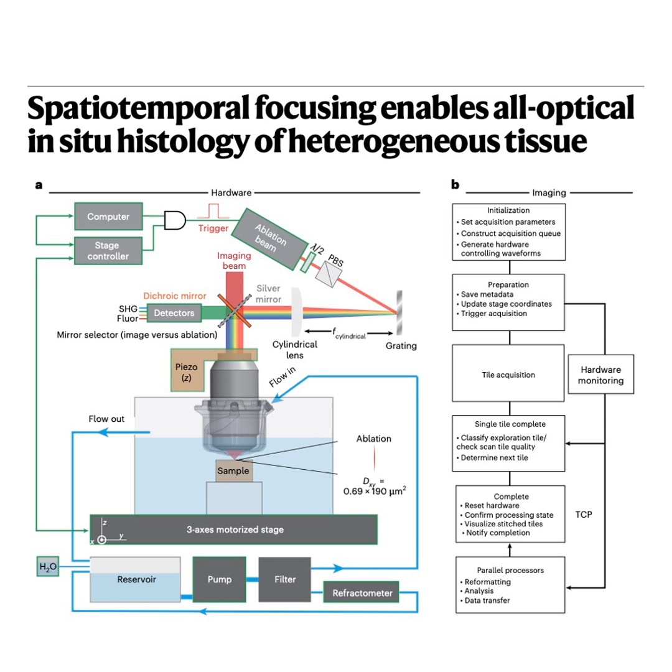It is. The main trade-off, however, is important to state. That's the downside. The method is destructive in the sense that the ablated tissue is vaporized by the laser. It's gone. You don't retain the physical tissue slices for other kinds of analysis, like histology stains or genetic tests, which you might do after mechanical sectioning. Ah, right. You get the 3D structure image, but not the physical substance itself for follow-up. Exactly. It's a choice between pristine structural data in situ or retaining the physical sample potentially with some distortion.